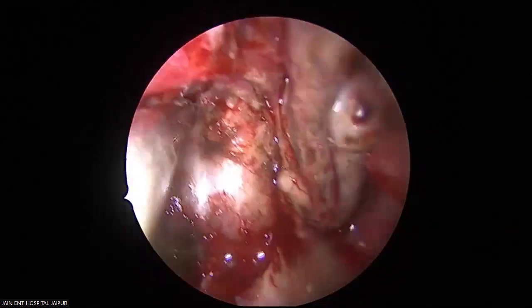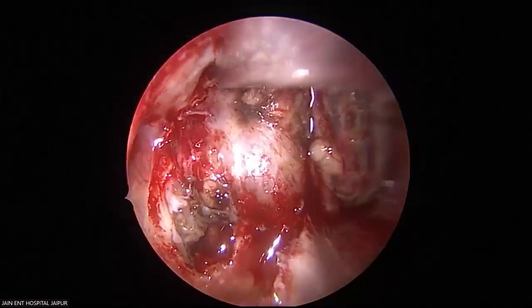See the bone removal. See the adequate bone removal everywhere.